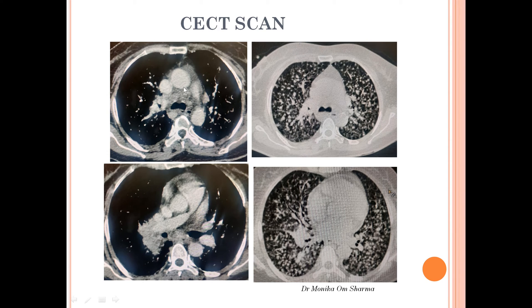This was followed by CECT chest. On the mediastinal window, at the level of the aortopulmonary window, we can see some nodes which are enlarged with a hypodense center and peripheral enhancement — these are necrotic lymph nodes in the right pretracheal and paratracheal distribution. In another image we can see another enlarged lymph node in the subcarinal distribution.